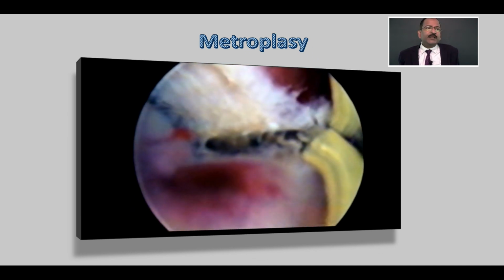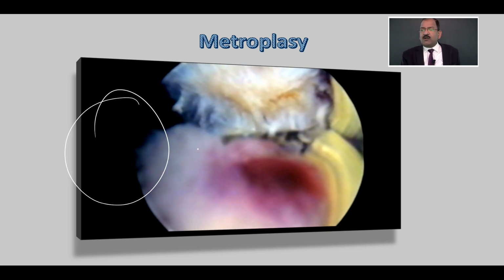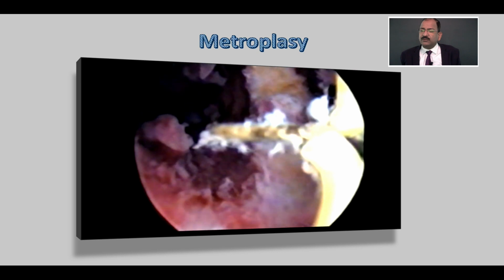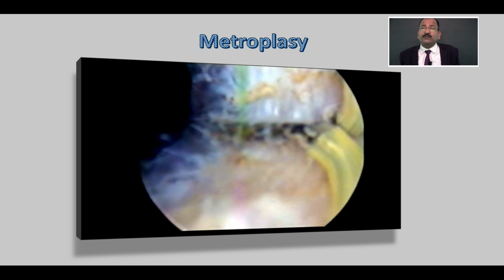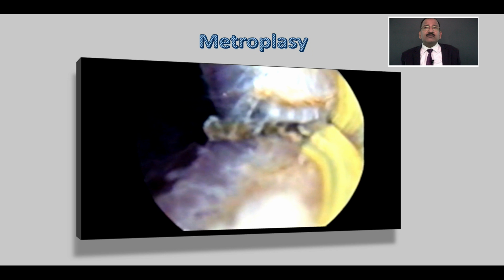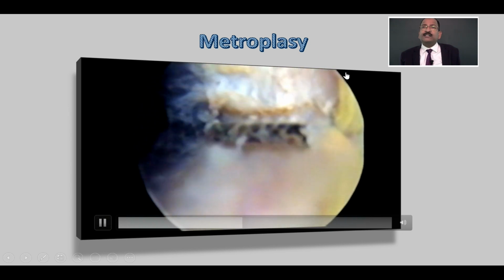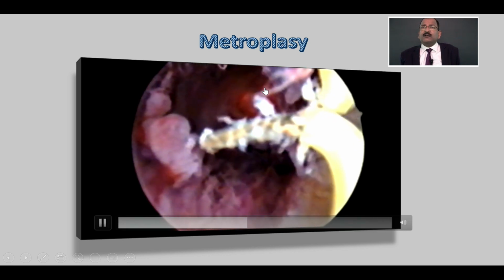And you should keep on comparing the texture of the surrounding wall. It is still dark, that means a long way to go. Without texture, you cannot perform hysteroscopy. This is texture, and now you will compare. Sometimes your friend who is holding the laparoscope from above can show you transillumination, and that transillumination gives you some idea about how much you still have to cover. So this is now becoming thicker, so you have to do it stepwise, and you have to cut one step, second step, third step.